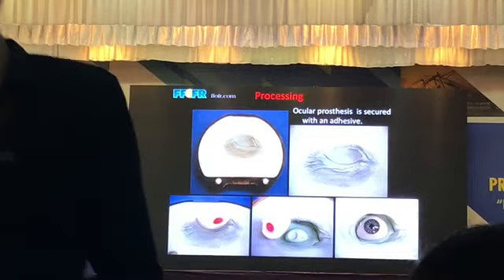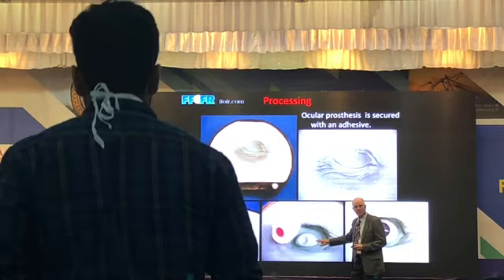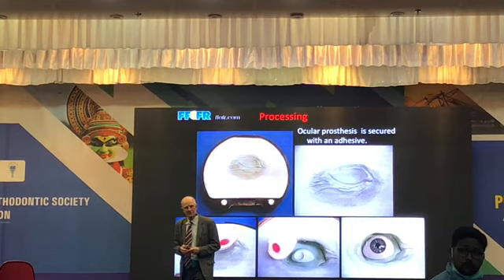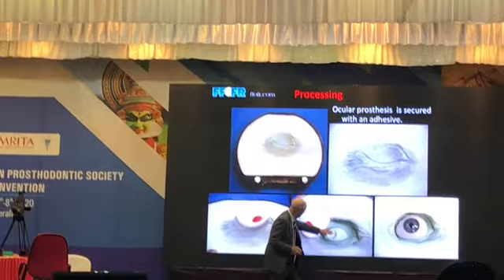And you'll notice that the back of the globe has little buttons, resin buttons on them. And that's to help orient or keep the globe in proper orientation during the processing. And actually what we do is take a little adhesive, cyanoacrylate, and glue this to the backside of the cast to keep the globe in position during processing. Otherwise it'll move around on you and the casting won't be accurate. So this part is very important right here.